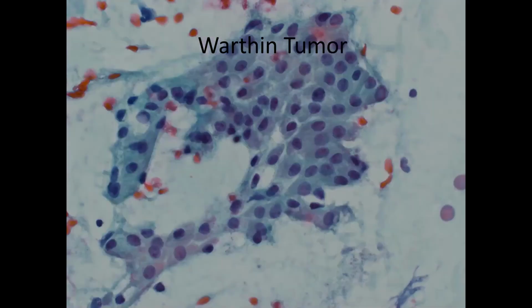Here it is in the Pap, and again, the Pap brings out both the nucleoli in these oncocytes as well as the granular nature of the cytoplasm. And you can appreciate that in oncocytes, the granularity tends to be very tightly packed as well as very fine. So it's much harder to appreciate the granularity in the Diff-Quik, much easier in the Pap, because the granularity is so tightly packed and so fine. So again, the key thing for the Warthin's is this tripartite composition, but the most important thing is flat sheets of oncocytes that have very densely packed, finely granular cytoplasm. And again, it should be almost all sheets.